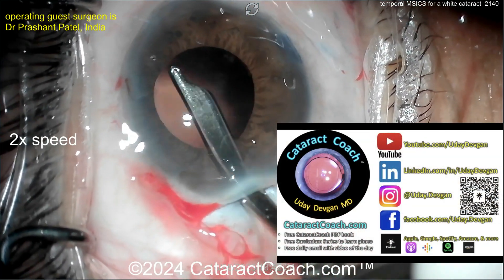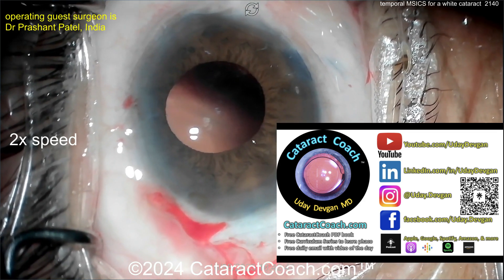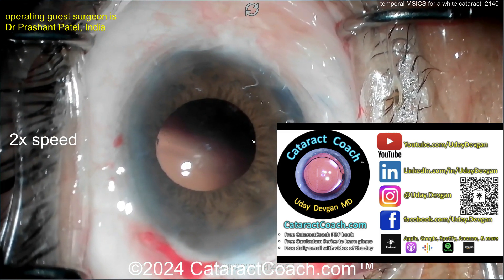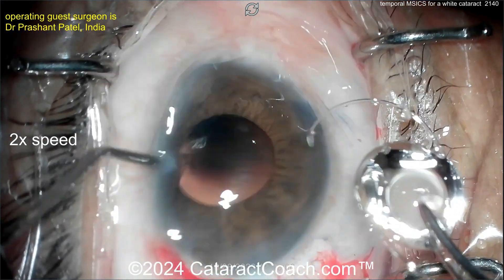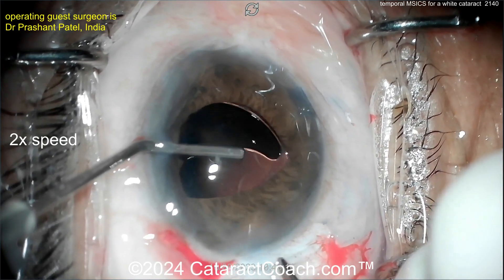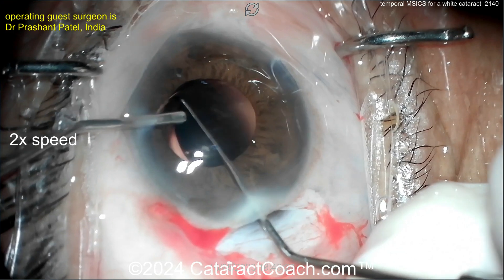Check out cataractcoach.com — our teaching website. So much good stuff there, way more than just on YouTube. There's a free PDF book and a whole series about learning phaco including MSICS — you better learn how to do this surgery. Now here comes the lens — looks like a single-piece PMMA lens. You've got a big incision, so why not put that inside the eye? Make sure you get it in the bag.